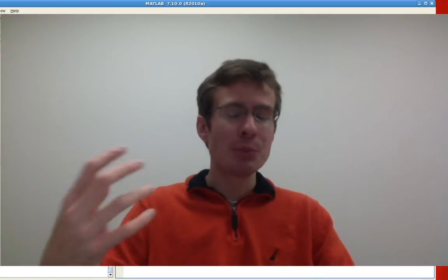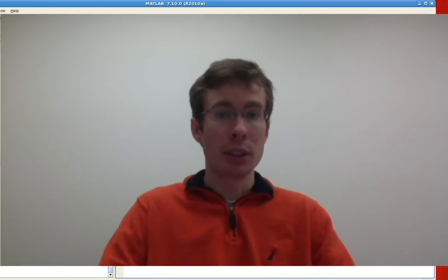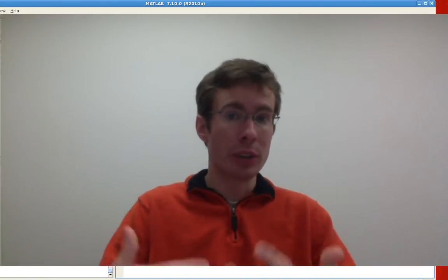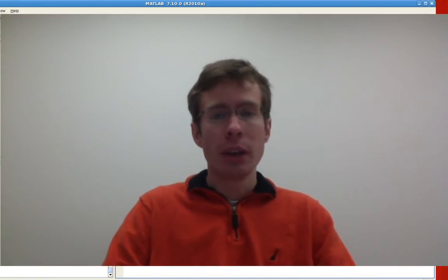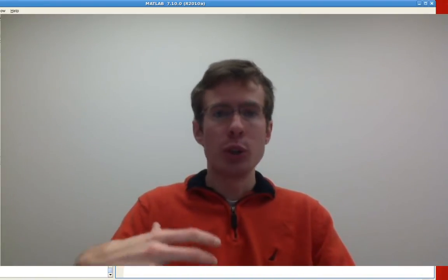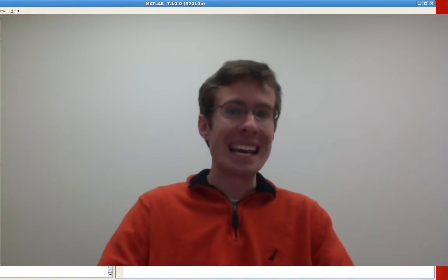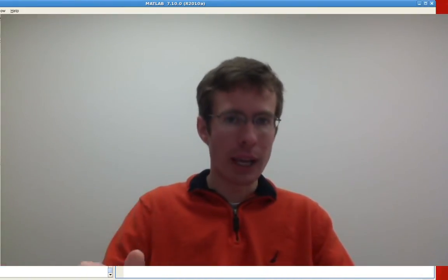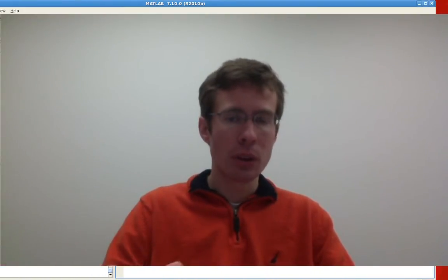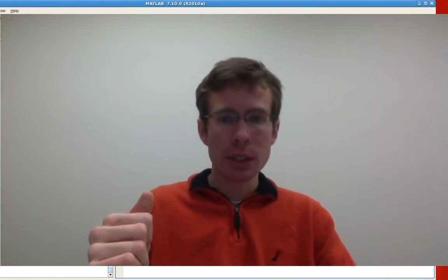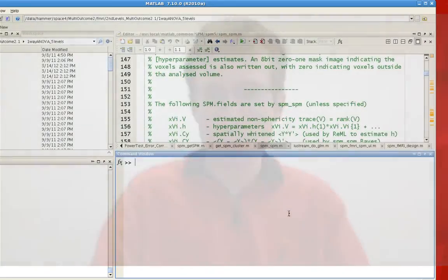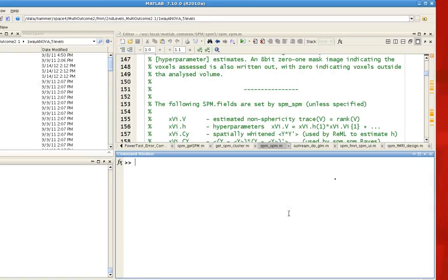However, with SPM, it keeps track of everything that's gone into a particular analysis and writes this out into a structure called SPM in all caps. To see this, there are actually a few different scripts within the SPM library which will allow you to see what each of the different fields specify.